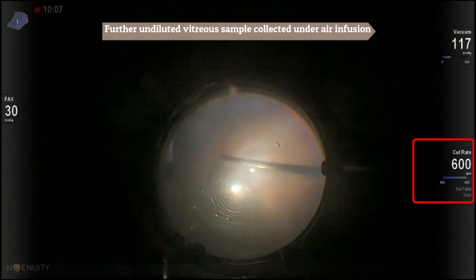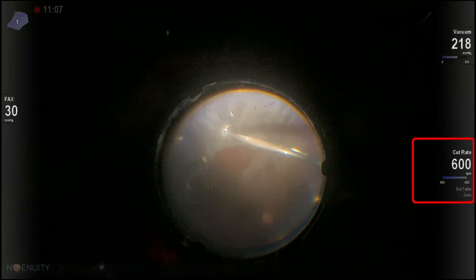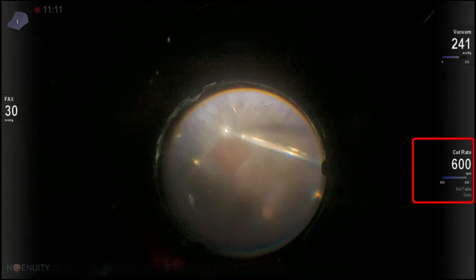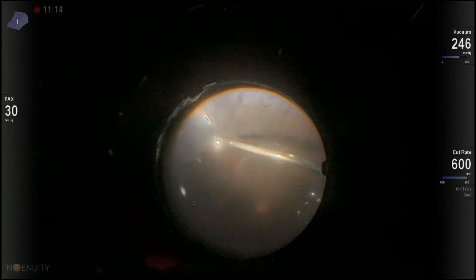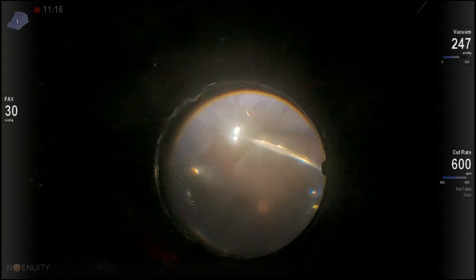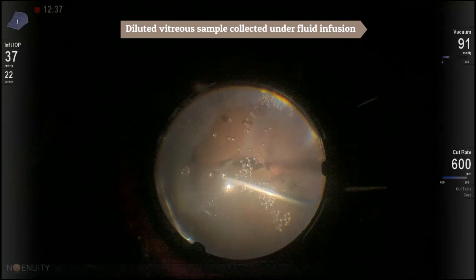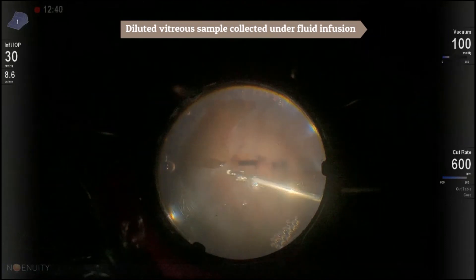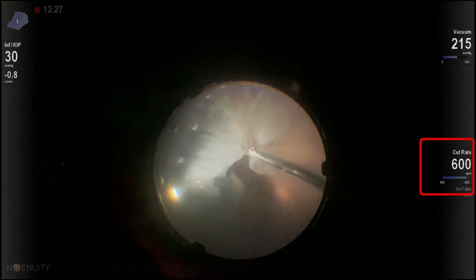This was done using a wide-angle viewing system and keeping the cut rate at 600. This was followed by diluted vitreous sample collection under fluid infusion. Arrangement was made to send both samples within half an hour for histopathology evaluation.